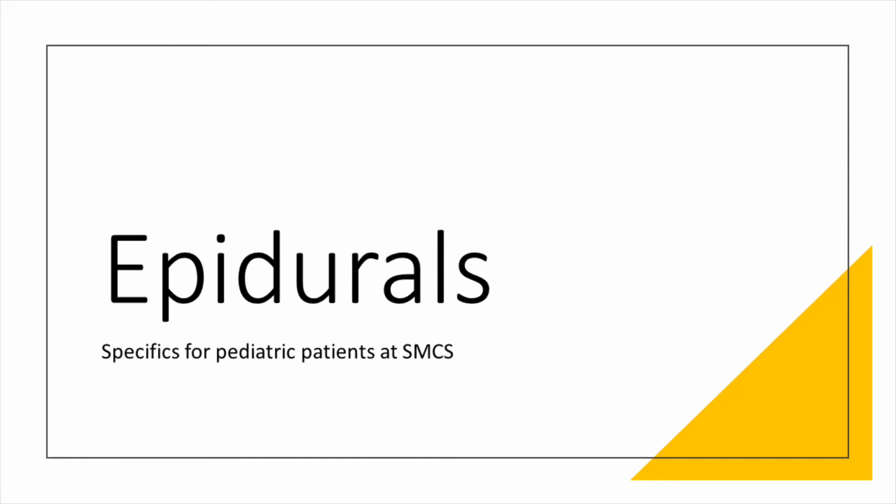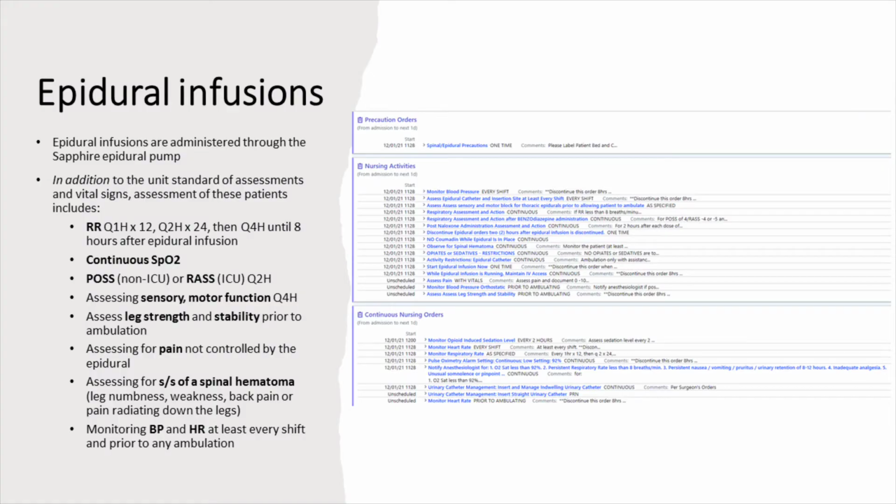We will now review epidurals and the specifics for pediatric patients at SMCS. Epidural infusions are administered through the Sapphire epidural pump. In addition to the unit standard of assessments and vital signs, frequent assessments are required. Please refer to the provider orders for details.